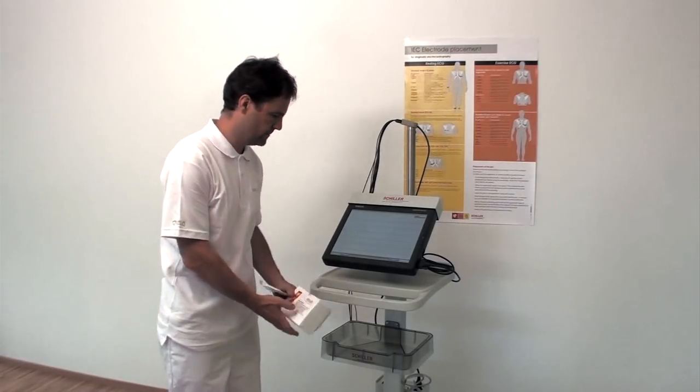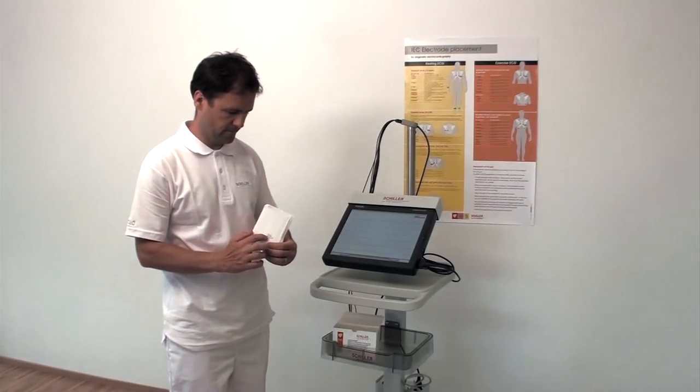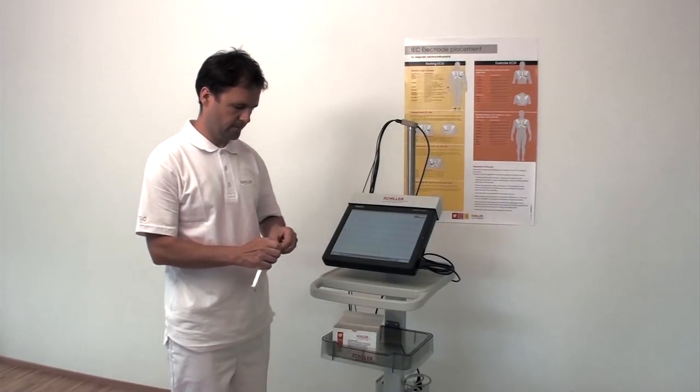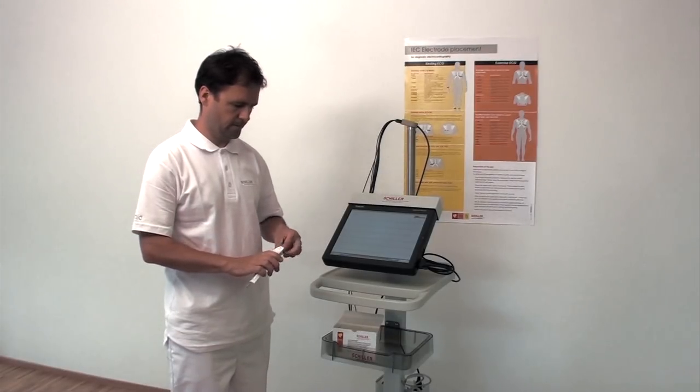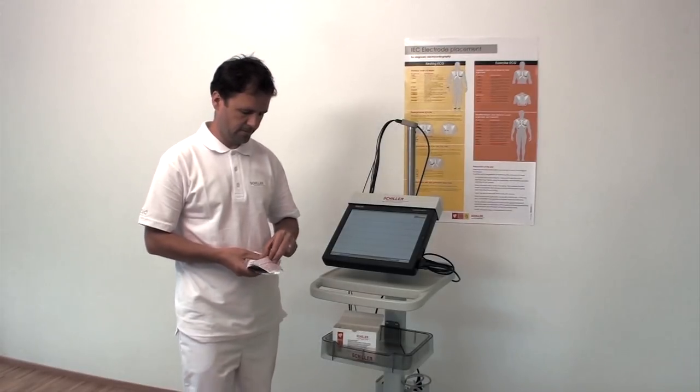The electrode greatly affects the transmission of signals from the skin. Therefore, check the expiry date on the package and ensure that the storage conditions stated on the electrode packaging have been adhered to. We recommend that Schiller electrodes are always used to ensure the quality of the signals.